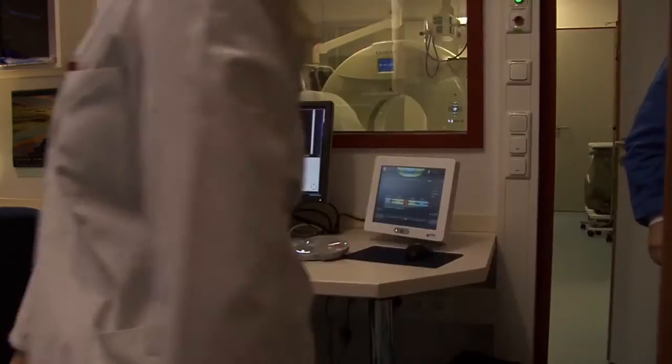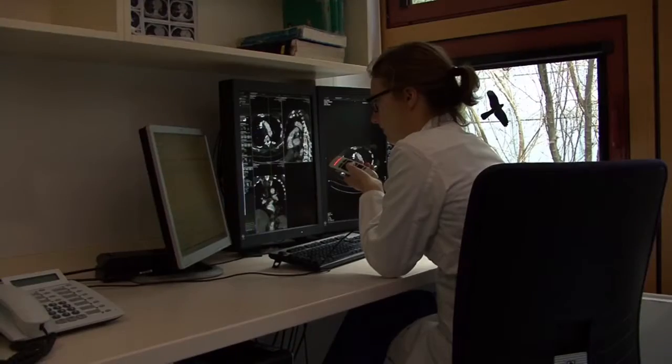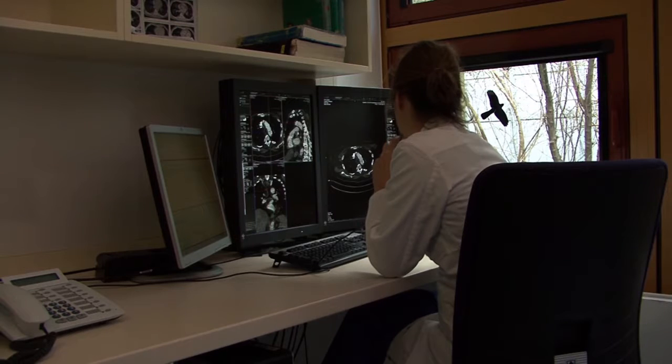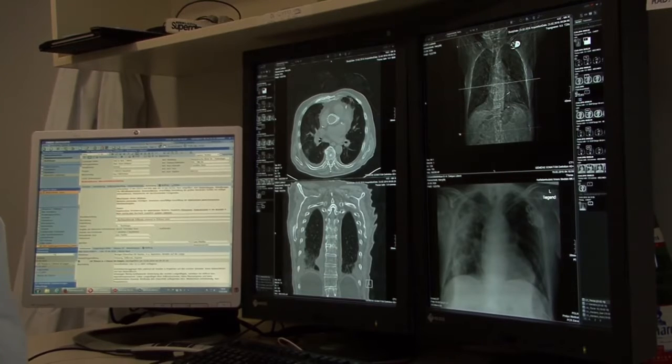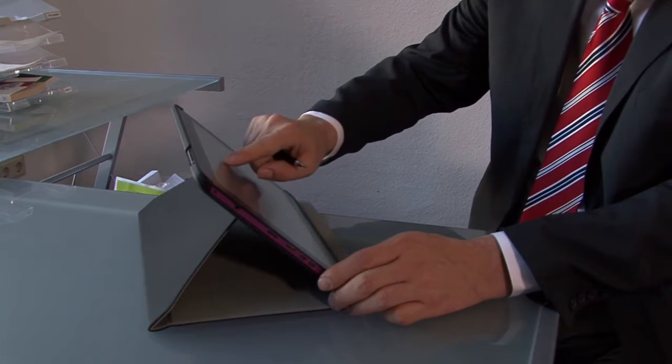Doctors have a high workload and doctors want everything immediately ready. So we've developed a separate software which prefetches images to the MedTab. So if a MedTab is close to a wireless LAN, it checks in the background whether there are images available. So it preloads those images.